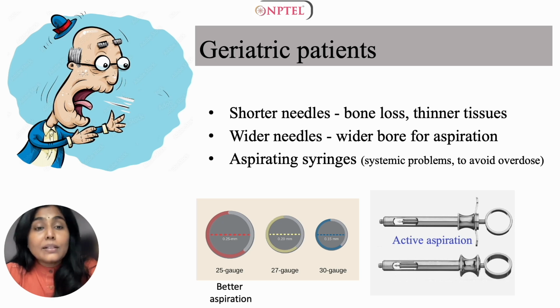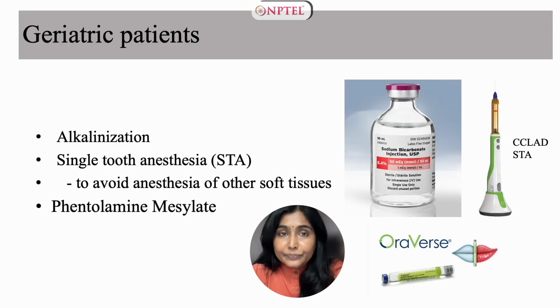So, we need to take utmost care to avoid overdose by proper aspiration. So let's use wide bore needles which permit better aspiration and aspirating syringes. Let's not have any compromise on that aspect.